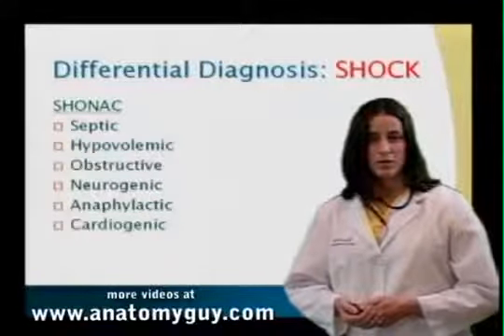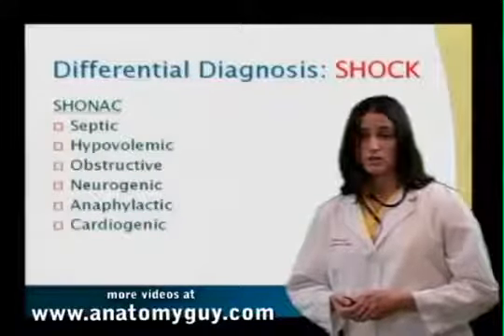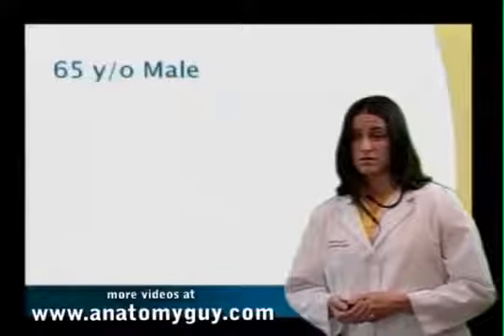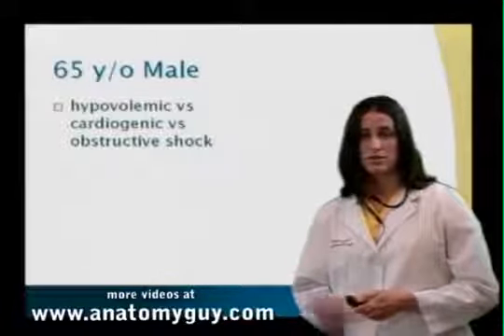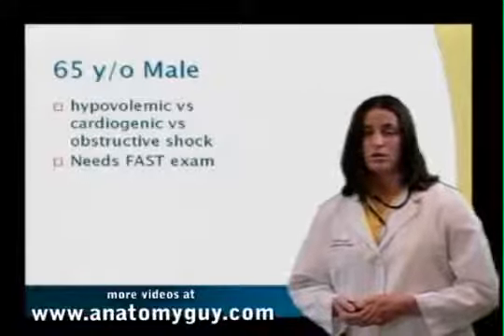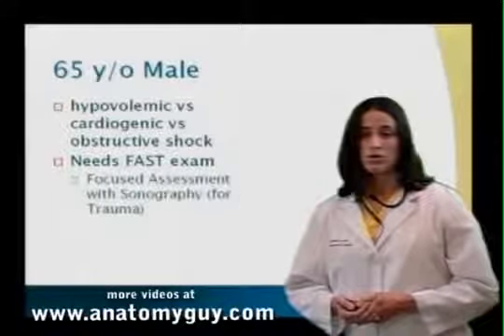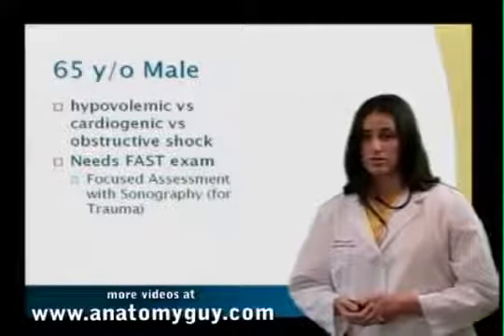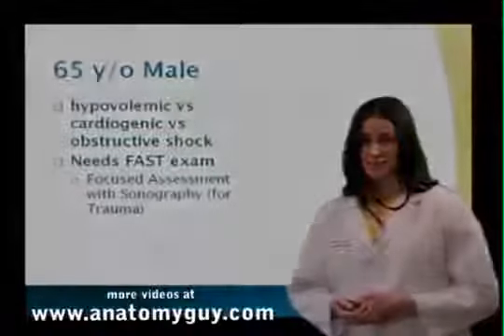Could this be cardiogenic shock? Possibly. He could be having a heart attack. His blood pressure is down. He has had diaphoresis. So to help us differentiate between these types of shock, we've narrowed this down to hypovolemic, cardiogenic, or obstructive. We can use a bedside modality for ultrasound, a FAST exam, or focused assessment with sonography for trauma, but there are medical applications, as we will see here. And with that, Dr. Byers will lead us through a FAST exam.